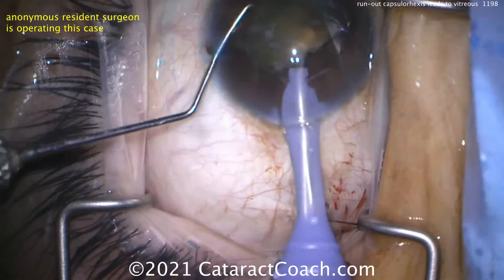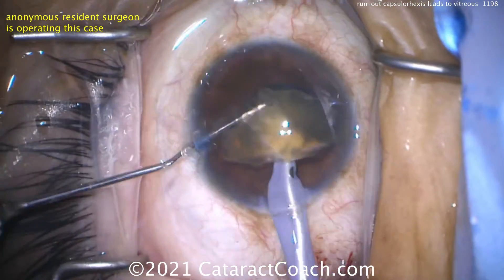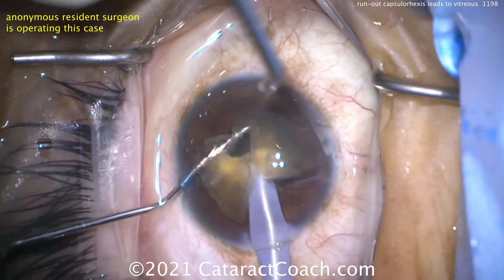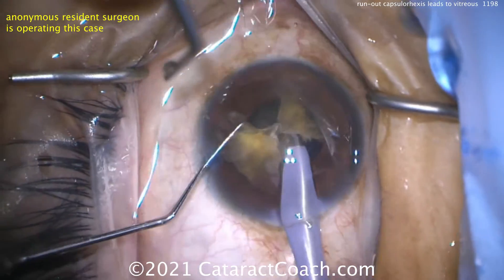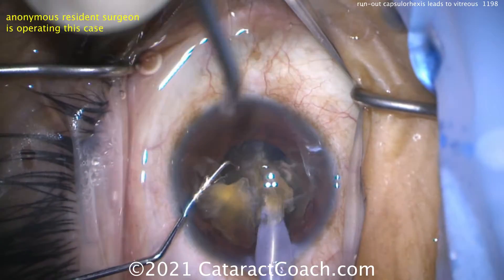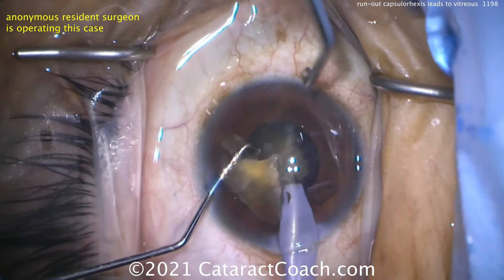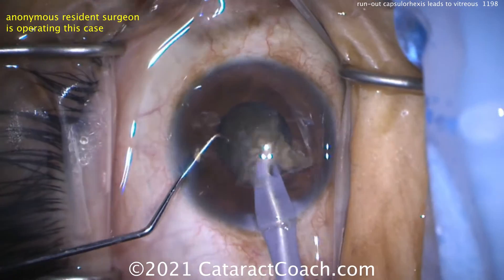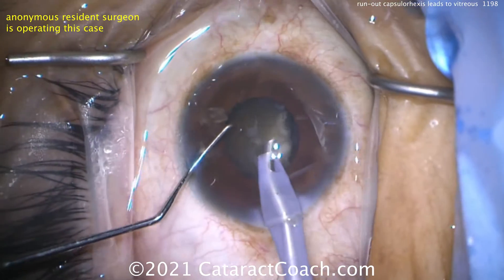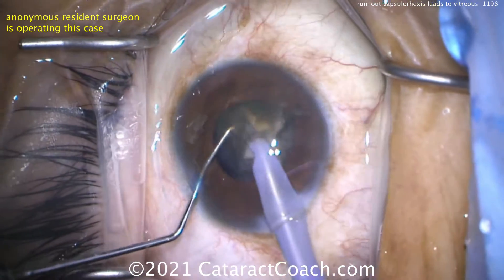You've got to be very careful about working in the capsular bag because of that run-out area. Think about it: if it's in the sub-incisional space and you try to do a groove — let's say a stop-and-chop — and you make that groove down the middle, when you separate or push the two halves apart you can put enough stress on the run-out area that it zips around to the back, to the posterior capsule. Now you've got a wide open posterior capsule.